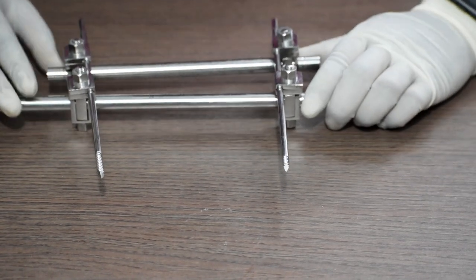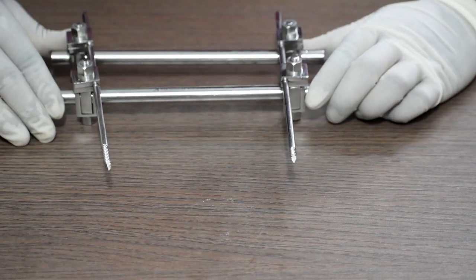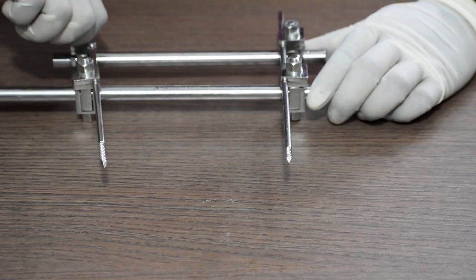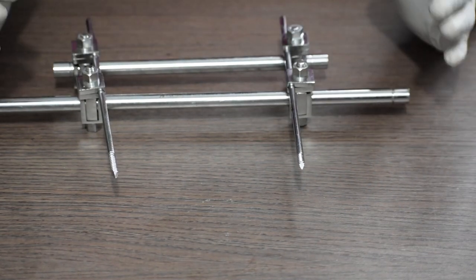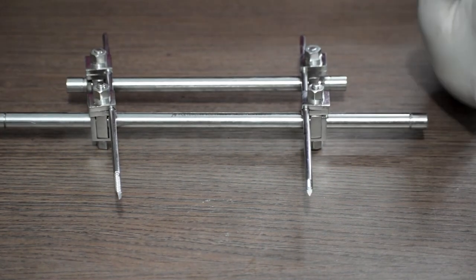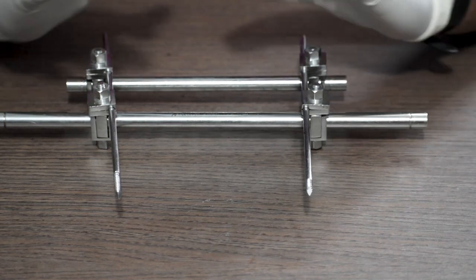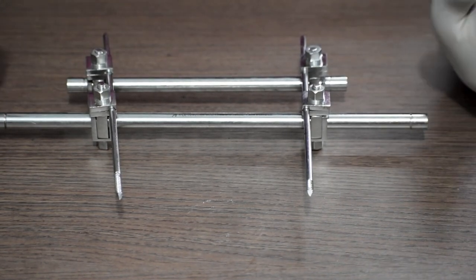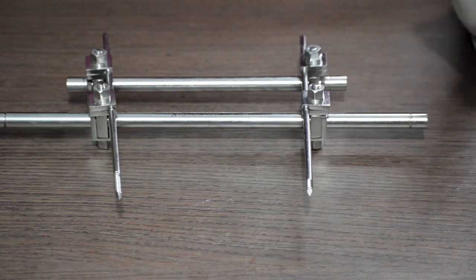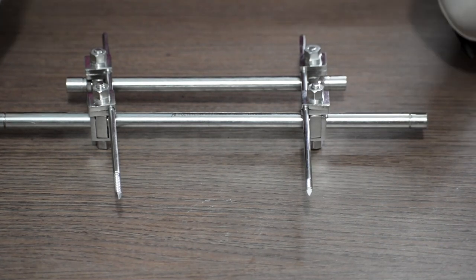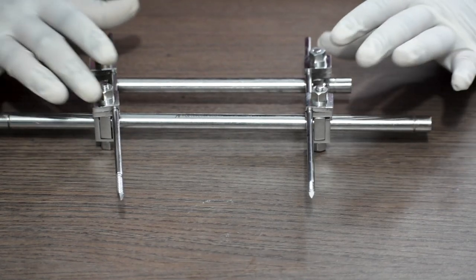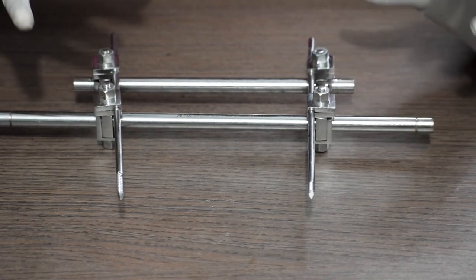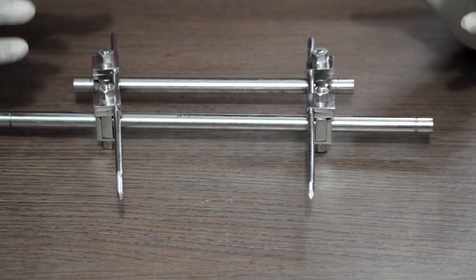Now, the size of the second rod will completely depend upon the surgeon's call. Usually, both the rods should be of same length. Double tubular rod fixations are done in order to give more stabilization to the fracture site.